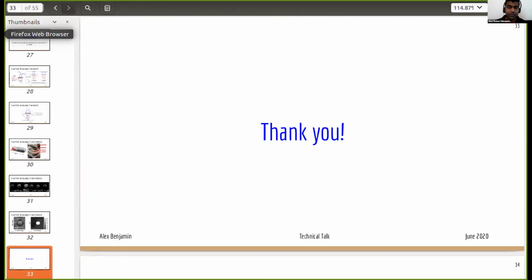But the probes that Brian mentioned will inherently produce tiny volumes. They won't be large volumes. You won't be able to capture the entire organ, but you'll get tiny volumes, which you'll have to stitch together to form the whole volume. So the architecture still carries over because you'll be able to localize these sub-volumes, and these sub-volumes can then be stitched together to form a larger volume. There are certain cases where stitching the sub-volumes is not as straightforward as just using the position and orientation information. In that case, you might have to rely on features within the volumes themselves to do some form of registration.